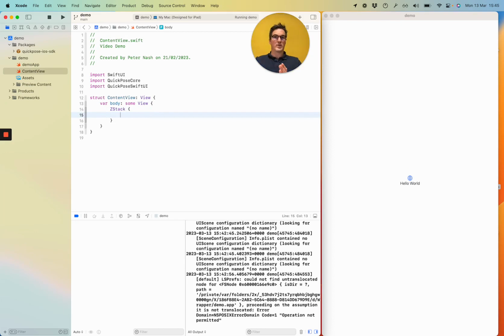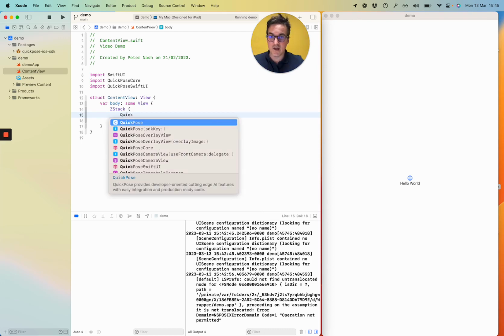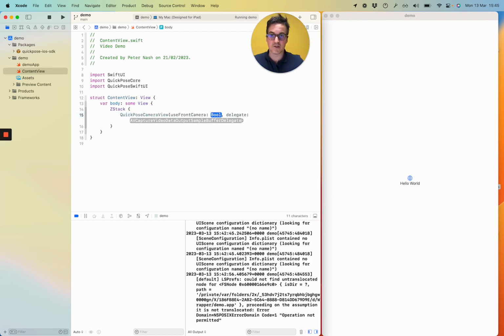what we do in QuickPose to make it more efficient is we have the camera feed running below, and then we render an overlay image on top of that. So we're not actually touching the camera feed, we're just loading overlay images which has our annotations on top. So let's bring in a camera view. So this would be our camera view if we were loading this on a device.